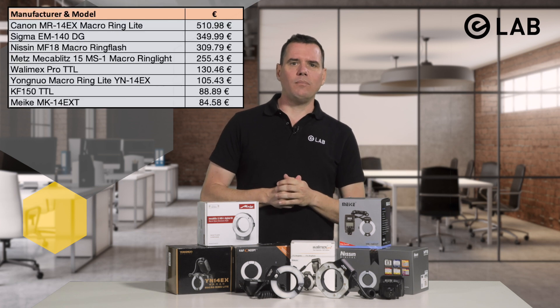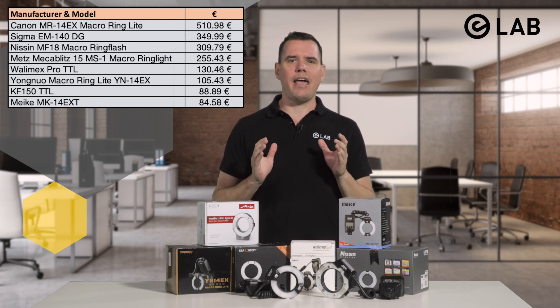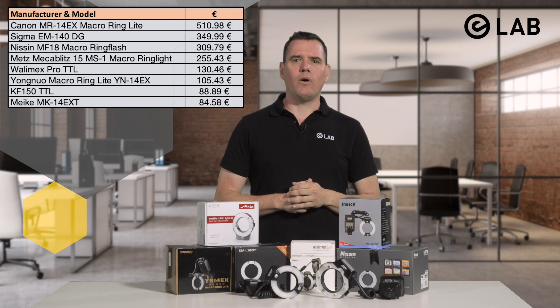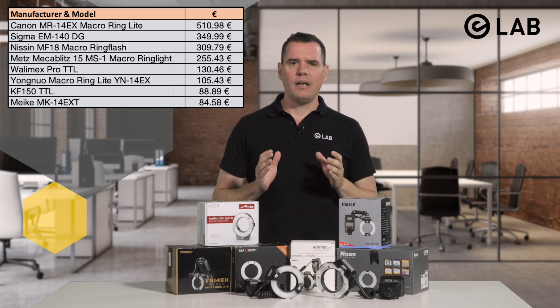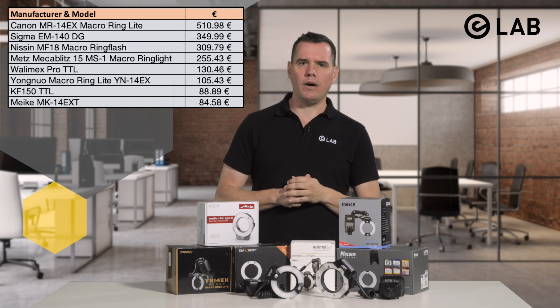Ranging from €255 to a whopping €510, we find the Canon MR14EX, the Sigma EM140DG, the Nissin MF18, and the Metz 15 MS1.